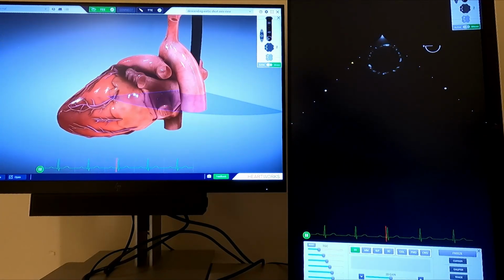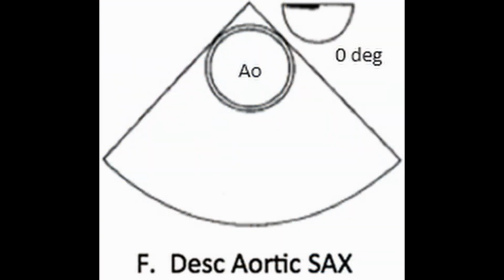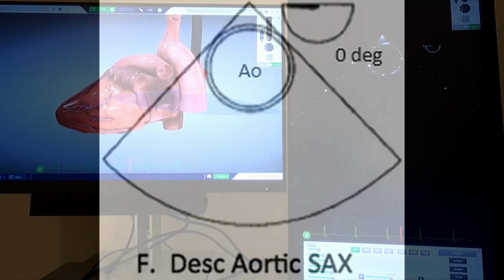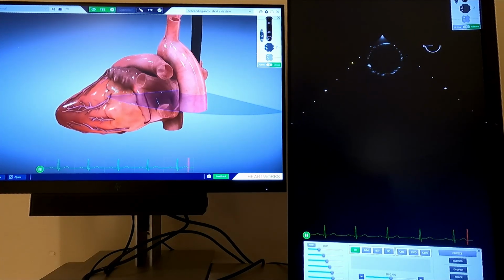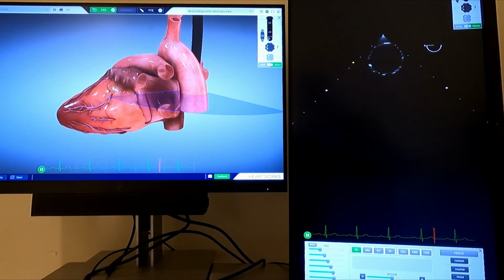This can be used to diagnose aortic dissections, however for our purposes, it is probably more commonly used to identify wire and device placement during procedures such as peripheral VA ECMO cannulation or placement of an intra-aortic balloon pump. By withdrawing and advancing the probe with the aorta in view, the entire descending thoracic aorta can be imaged.